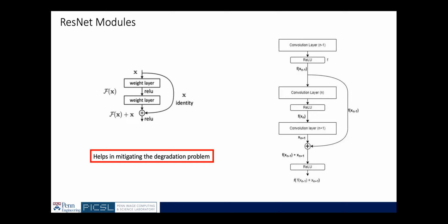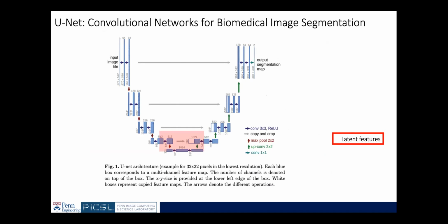Yeah, so what is the copied feature map in UNet? It is basically the output from that particular convolution block at this particular stage. So let's see, over here you have the output, and you have the output from this particular block. You take this last layer, whatever output you get at this stage, and the output from this other stage, and concatenate them along one dimension. Of course, you need some cropping so that both of them match the dimensions.